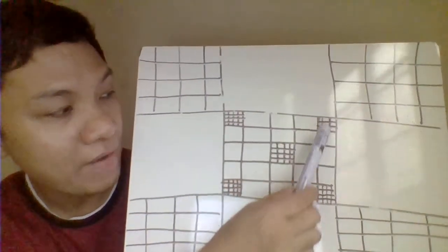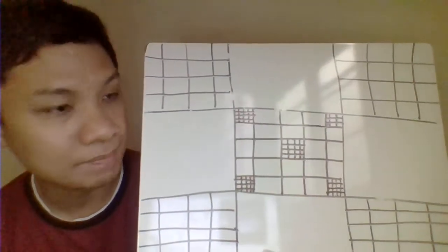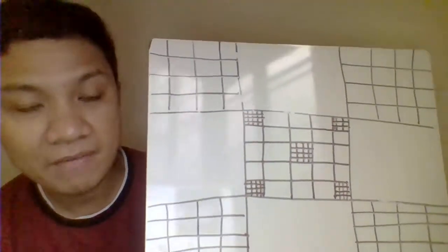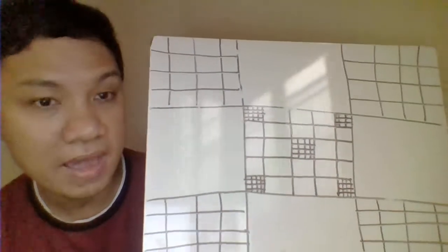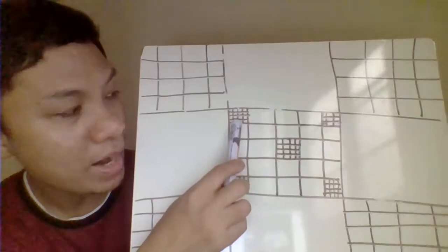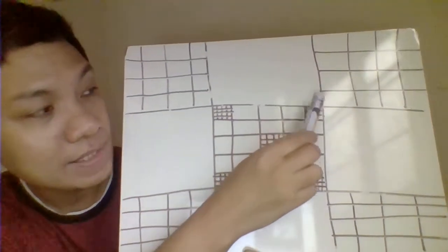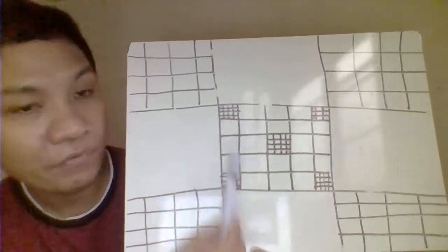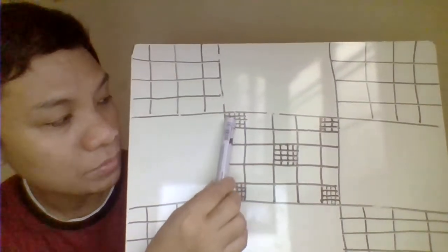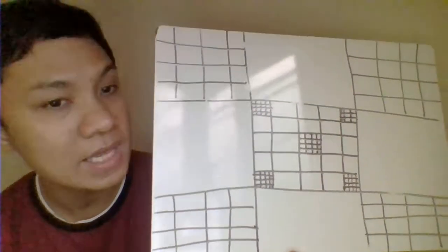The central square, on the other hand, where we count your RBC, is divided into 25 smaller squares: 1, 2, 3, 4, 5 by 1, 2, 3, 4, 5, that's 5 by 5, 25 smaller squares. Each of the smaller squares is further divided into 16 smaller squares, 4 by 4, that's 16.